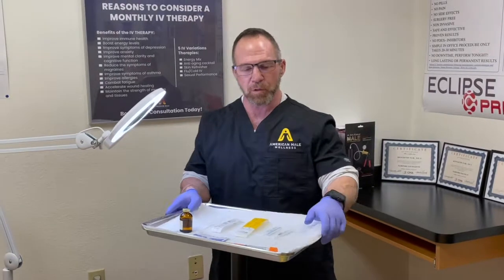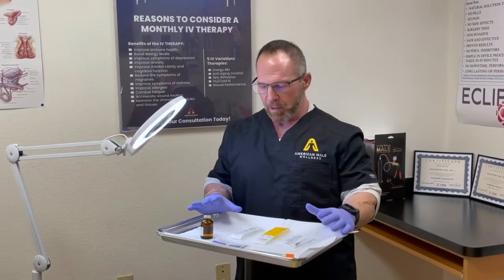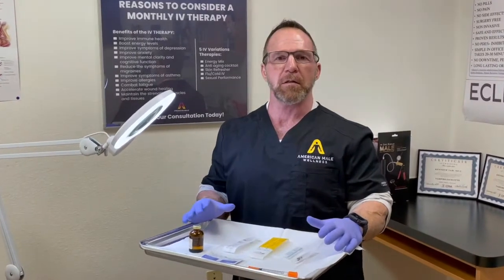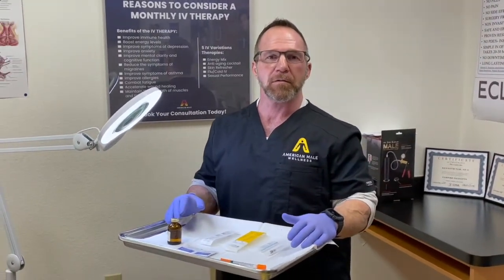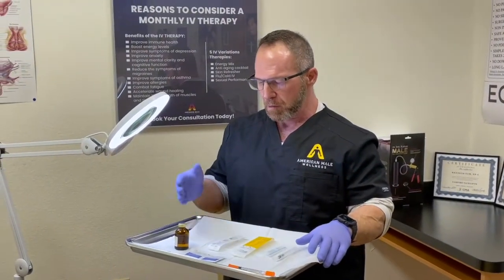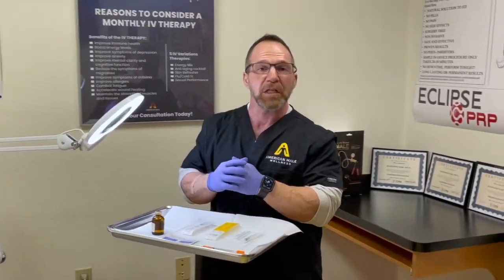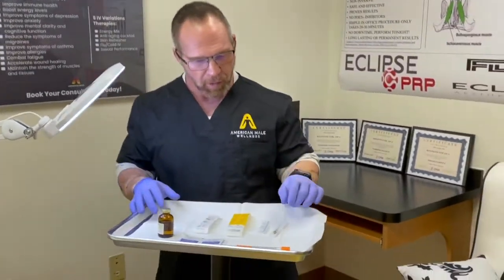Hey guys, George with American Male Wellness. Today we want to talk about how to inject testosterone — how to load it, what type of syringes to use, the gauge of needle, good technique, and where you can safely inject testosterone without causing any infection.